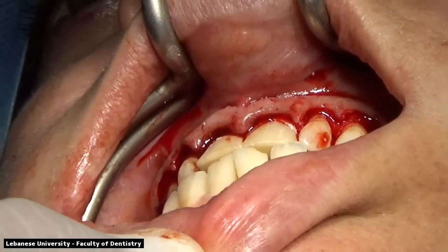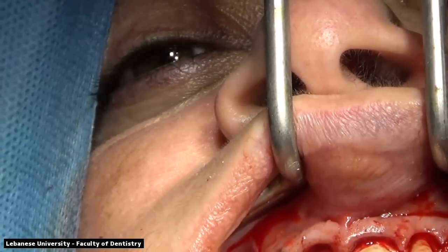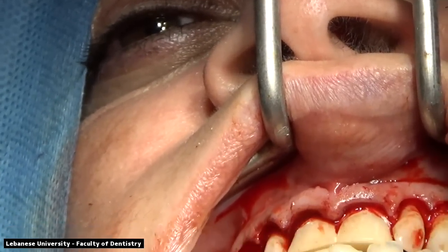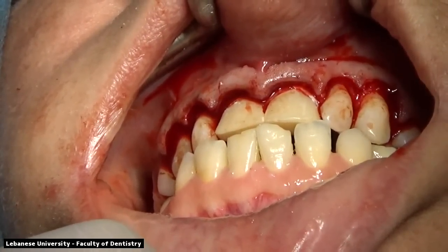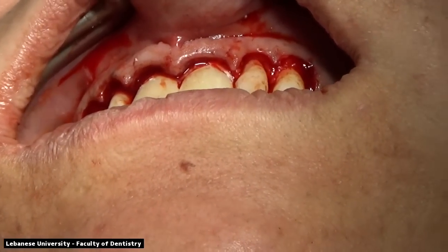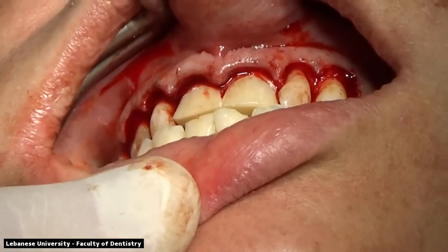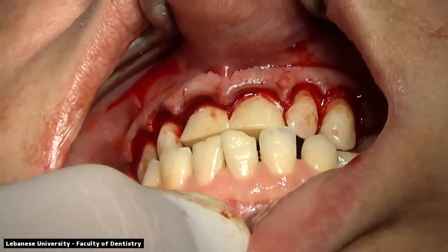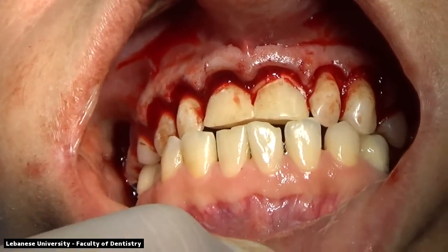The patient is closing right now to make sure that there is adaptation of the provisionals to the abutments. The patient has a crossbite, so we're trying our best to create an edge-to-edge as much as possible. We cannot create a normal overjet and overbite in this case, but if we can get an overjet kind of case, it would be preferable.